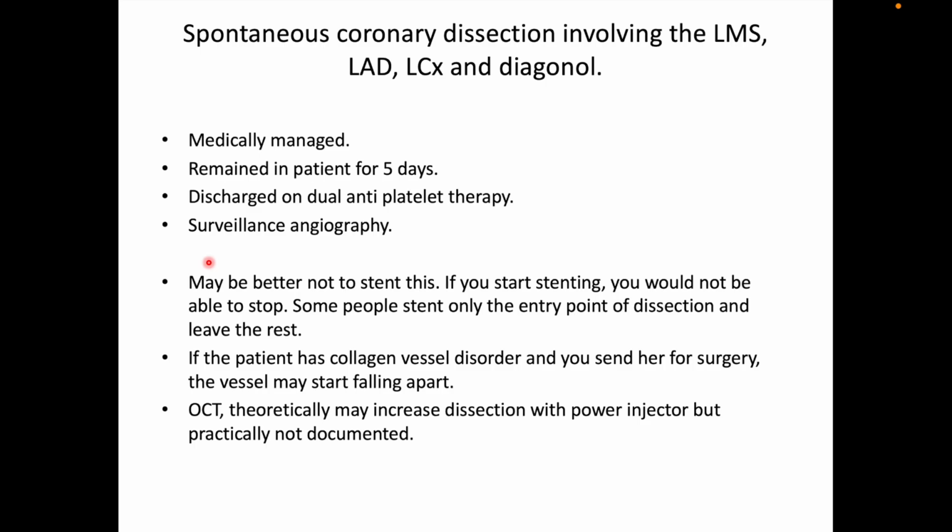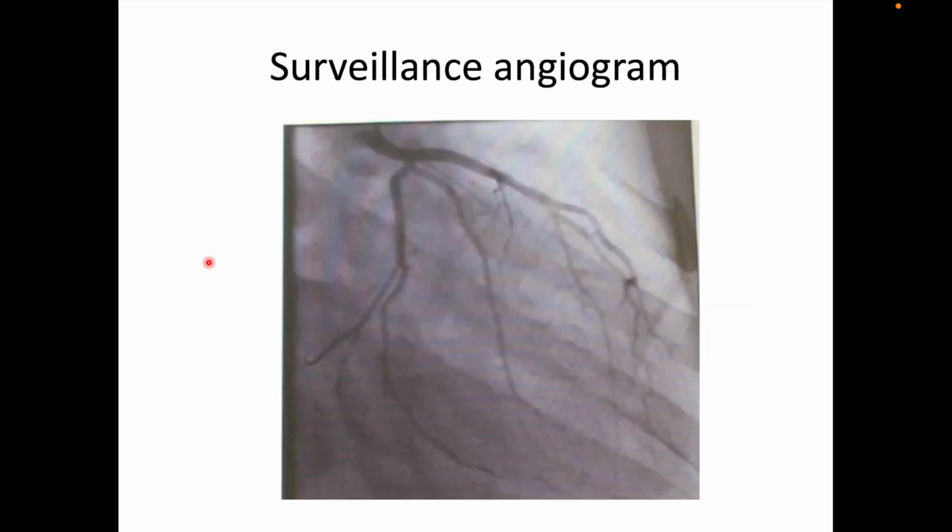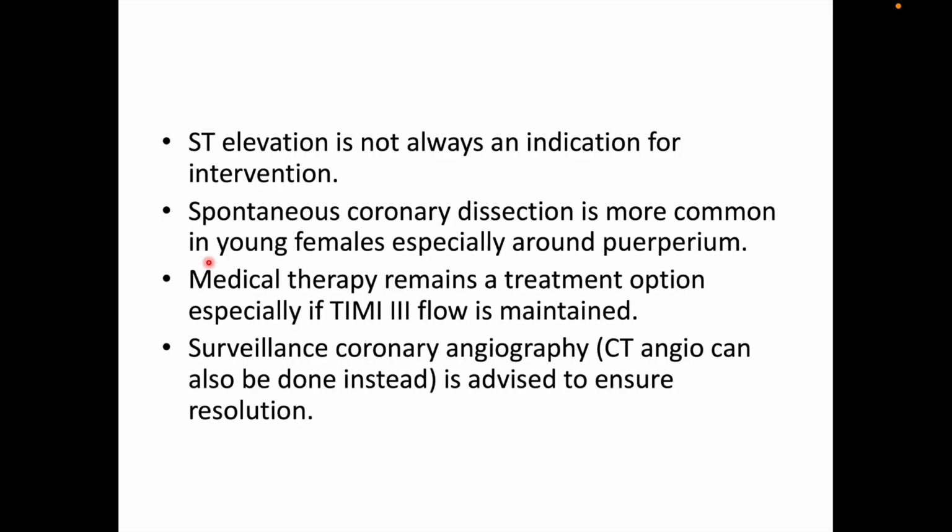OCT theoretically may increase dissection with power injector, but practically it's not documented. This is the surveillance angiogram of this patient done after 3 months. Everything has healed and the angiogram is back to normal. So ST elevation is not always an indication for intervention. Spontaneous coronary artery dissection or SCAD is more common in young females, especially around puerperium. Medical therapy remains a treatment option, especially if TIMI 3 flow is maintained.